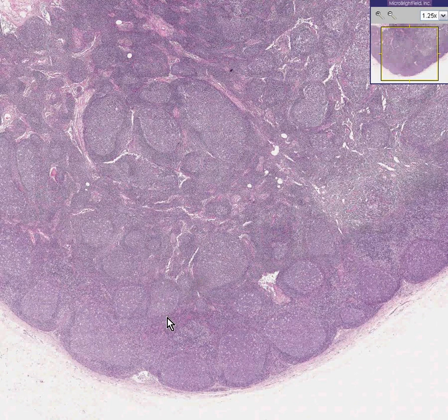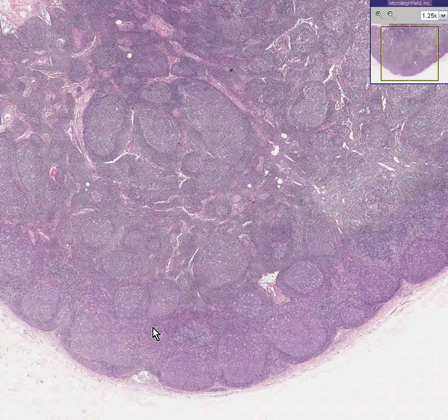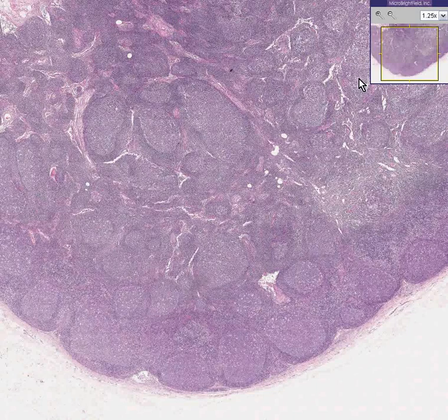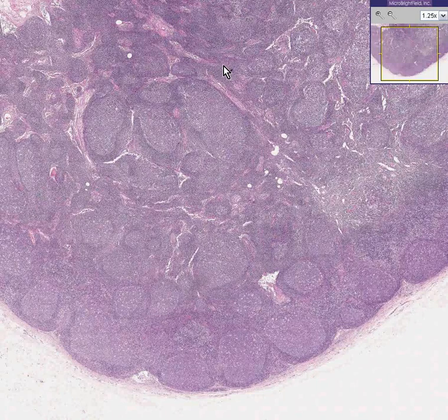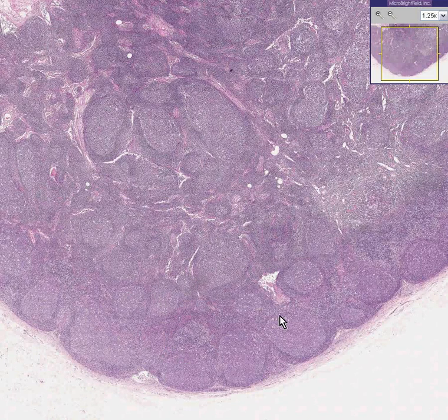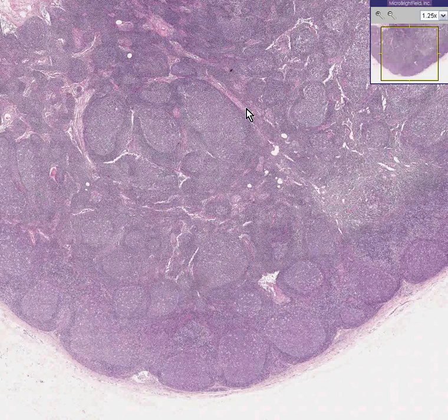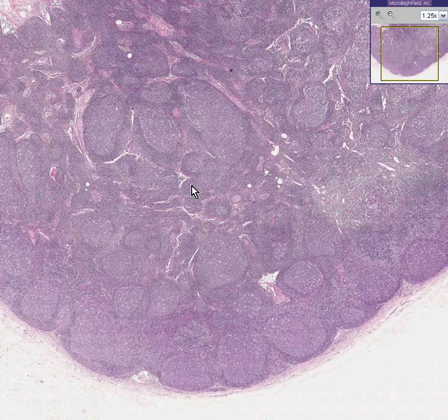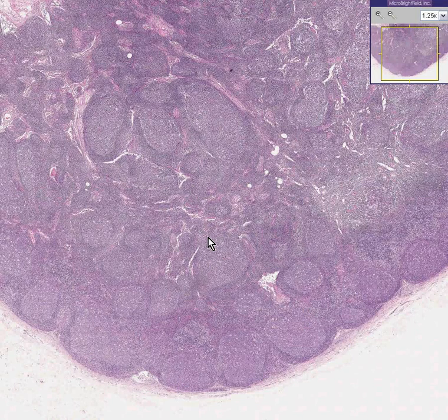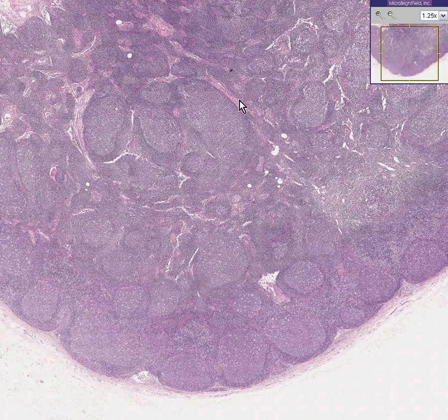The other type is when the medullary cords and sinuses, especially the sinuses, become prominent and may overwhelm or push out or lessen the follicles. That one is called sinus histiocytosis, or a hyperplasia of the medullary sinuses. So the two benign ways a lymph node reacts to inflammation are either follicular hyperplasia, which this is, or sinus histiocytosis, in which you have prominence of the medulla.